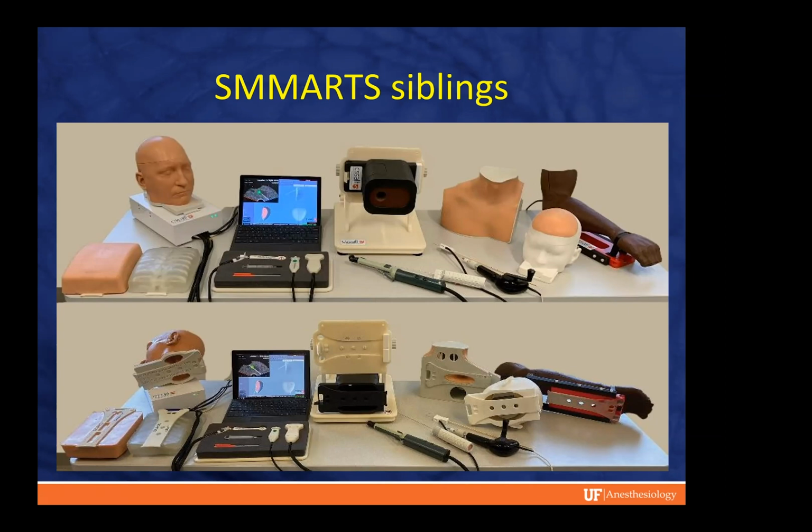Largely because while the technique and what you're trying to accomplish is very familiar to a urologist, they spend less time interacting with ultrasound, and being able to reconstruct the 3D anatomy from a series of 2D images is probably a more difficult task to learn if you don't do it that often.